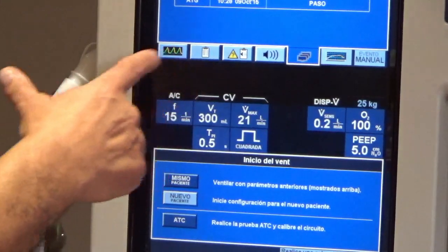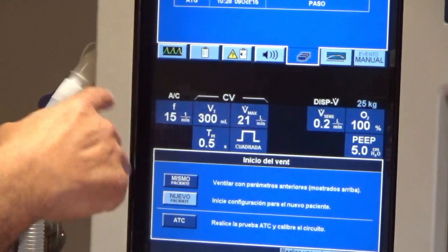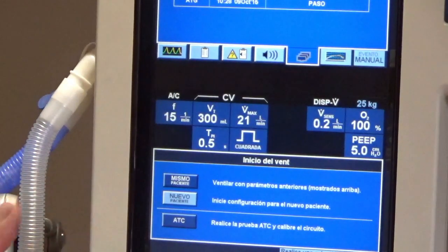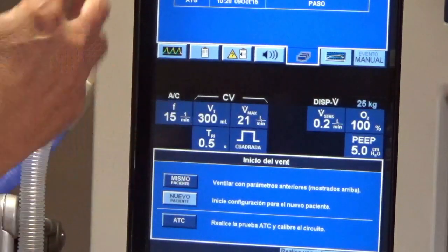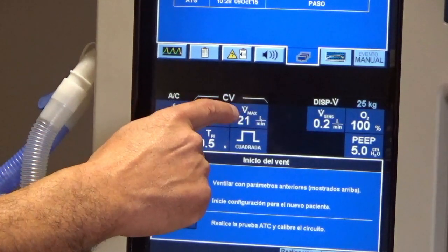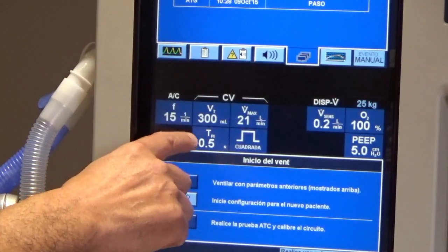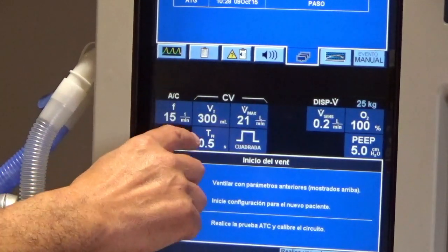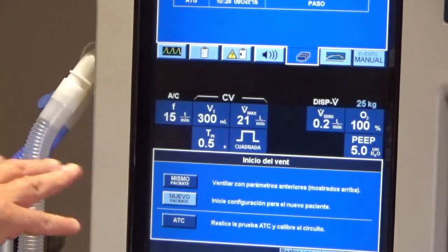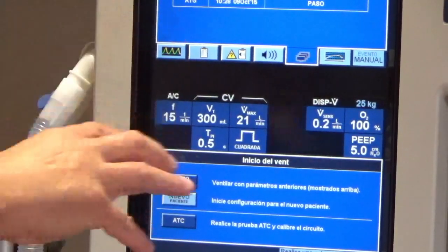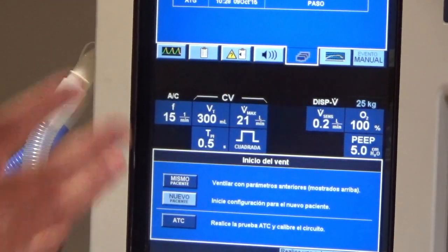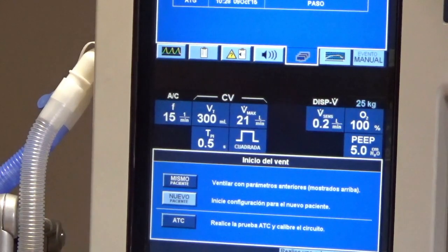First of all, we can check the different parameters that are in Spanish, and I can translate each one for you. This is the respiratory rate, this is the tidal volume, this is the peak flow. We have here the pause time, necessary in this particular ventilator to set up all the settings. This is one of the differences between this ventilator and the MAQUET Servo-I, explained by Mireia.